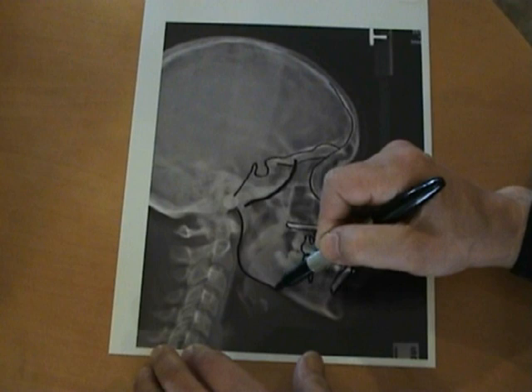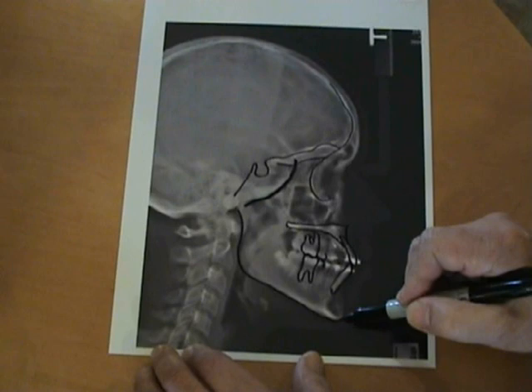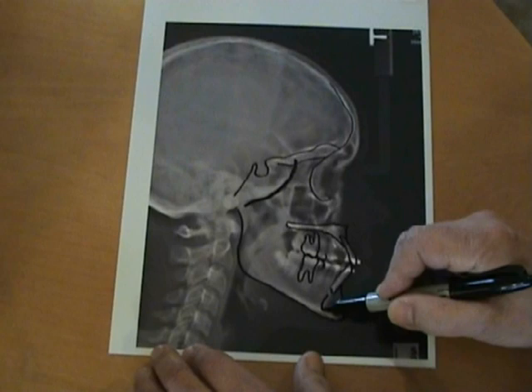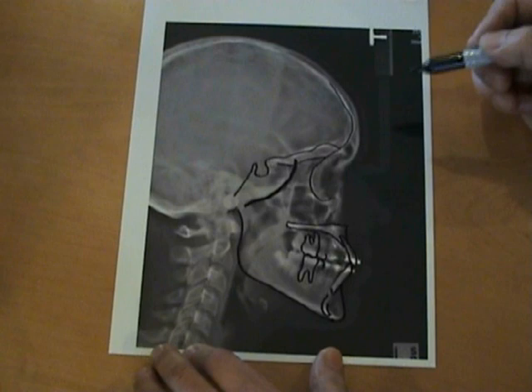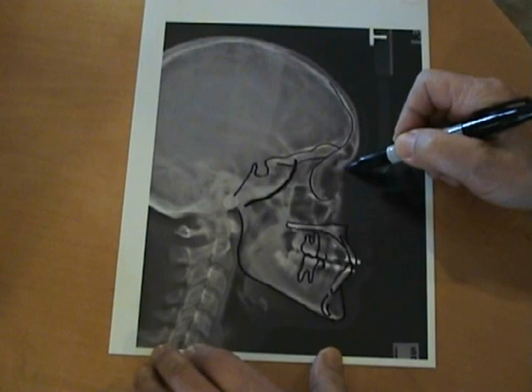Posterior border of the ramus. Inferior border of the ramus. Menton is right here. Pogonion is right here. Nasion. It's right here.